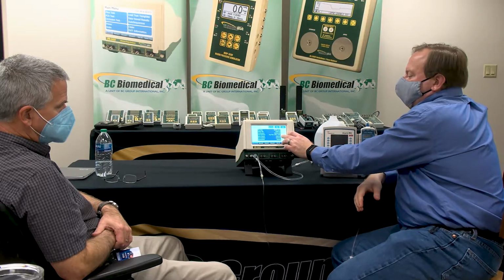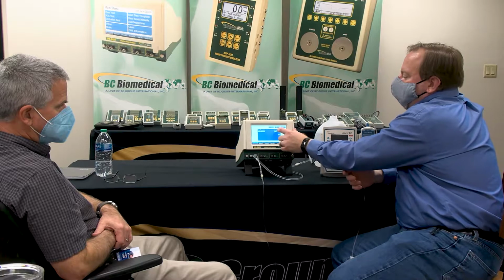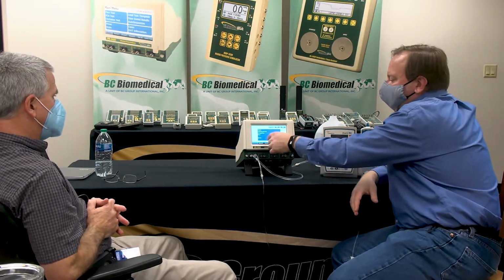The test tolerance, just like the ESU: what are you interested in? Do you care about the volume delivered, instantaneous flow, average flow, or maybe we don't want a tolerance? Just run the test, give me the data. I just want to meet it. So you have all those options here.